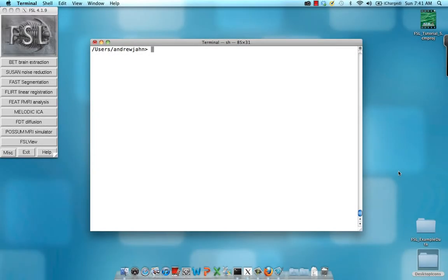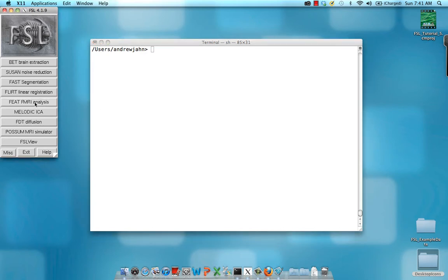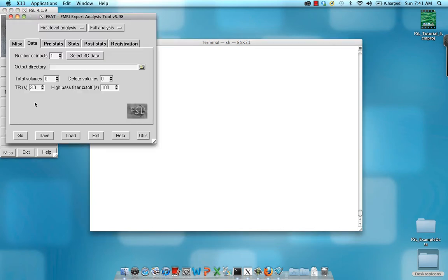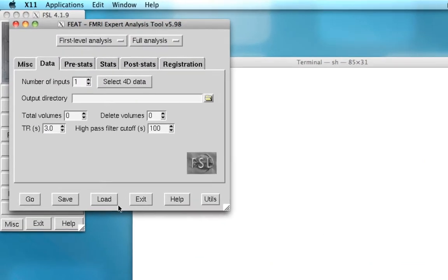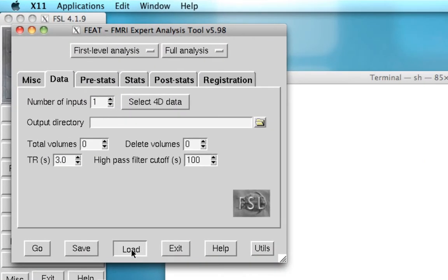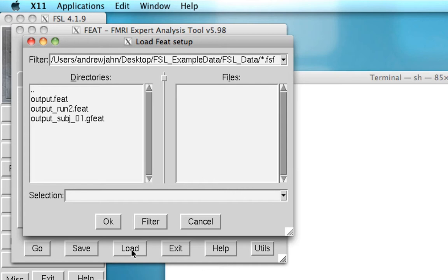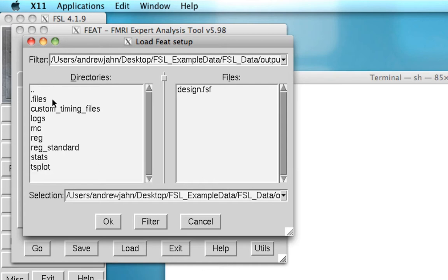This walkthrough is going to cover how to automate your FEAT analyses through FSL's .fsf files. First thing to know is if you open up FEAT and click on load, each time we've run an analysis in each of these output directories such as output.feat, there's a file called design.fsf.